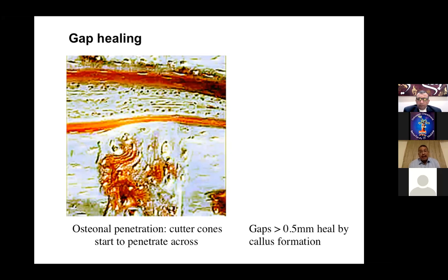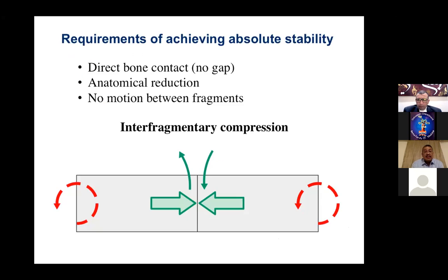This point again will determine the success or failure of our surgical technique if we put our fracture under absolute stability. If you have a gap, please leave the holes of the plate opposite the gap to allow some motion to heal the fracture. Leave 2 or 3 holes opposite the fracture area. This will give a chance for healing. We will come again to this point later.